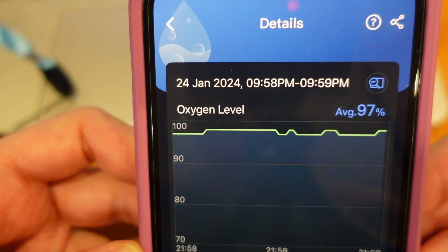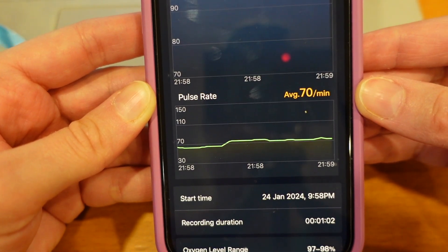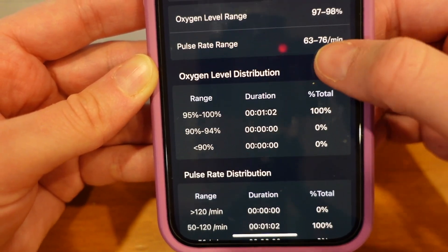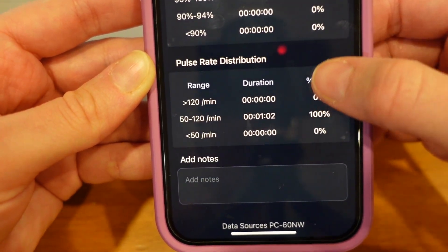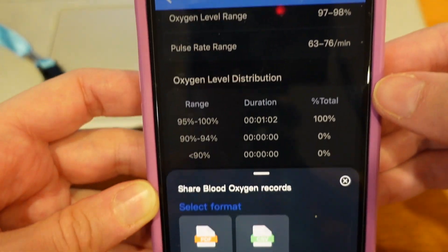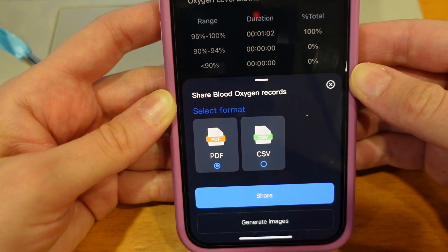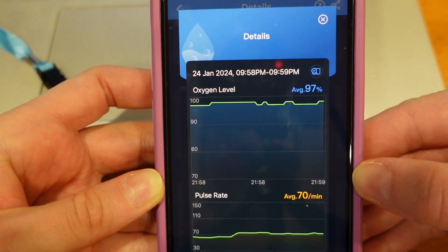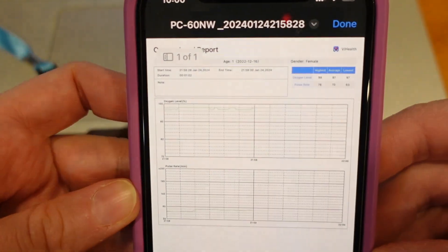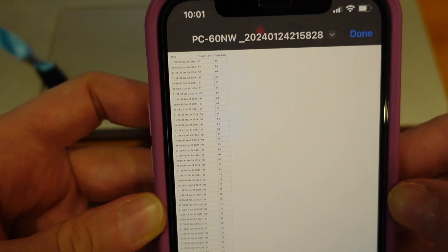In the session details you will find the date and time of the recording, the ranges, the duration, the distribution, and you can add notes from this session if you wish. If you click on the button in the top right corner you can choose to share this record in PDF or CSV format, or click on generate image to share it as an image. Here is what the PDF looks like, and this is what the CSV format looks like.